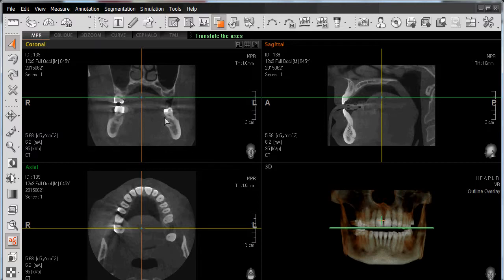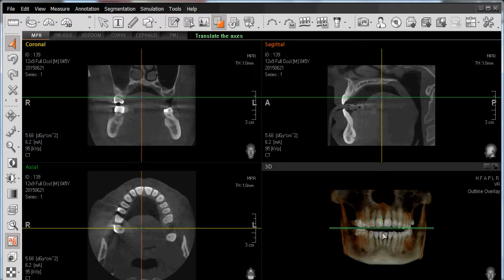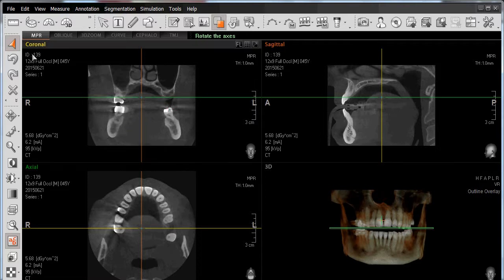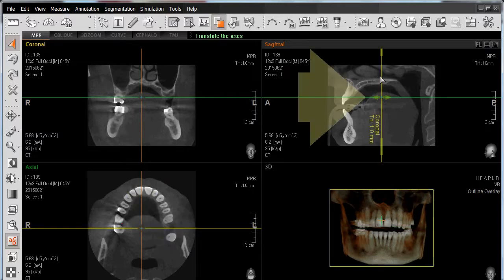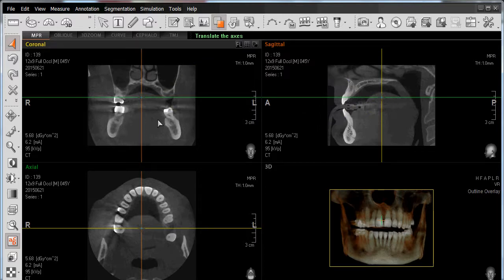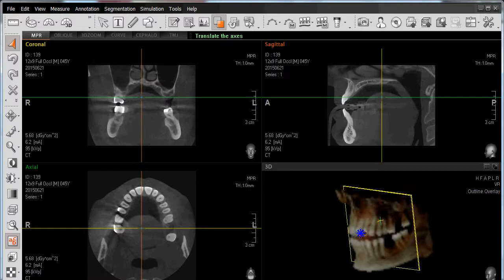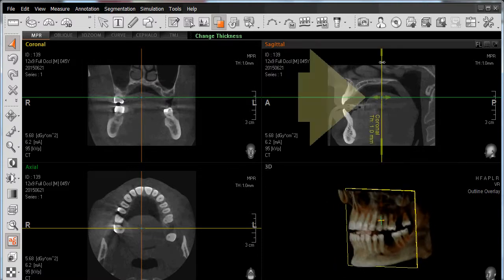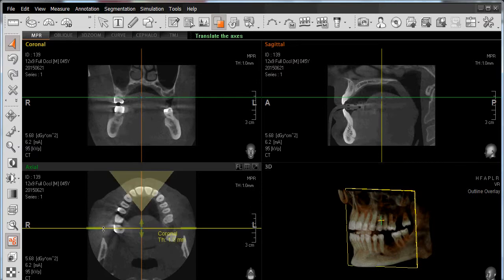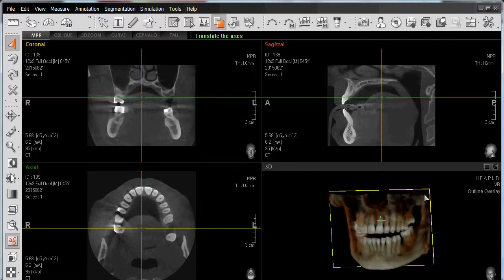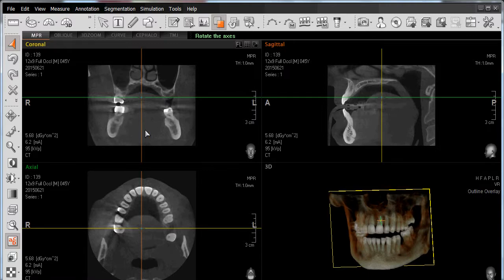To help us identify where we are in the anatomy, we're going to use the 3D rendering in the bottom right-hand corner. Starting with our coronal view, with the label being yellow, it identifies the axis lines that are creating the view in this particular window. This coronal line here, as well as this coronal line over here, are generating the view in the coronal window. Rotating the image, you'll see that the line going from superior to inferior border of the scan corresponds to the vertical line, and the line going from right to left is creating our view in our coronal window.